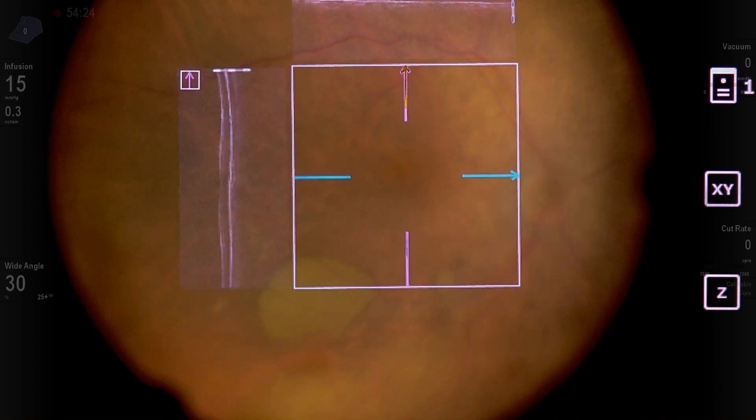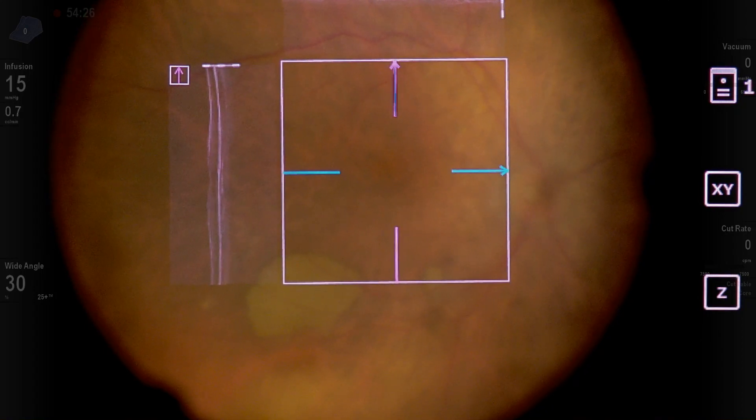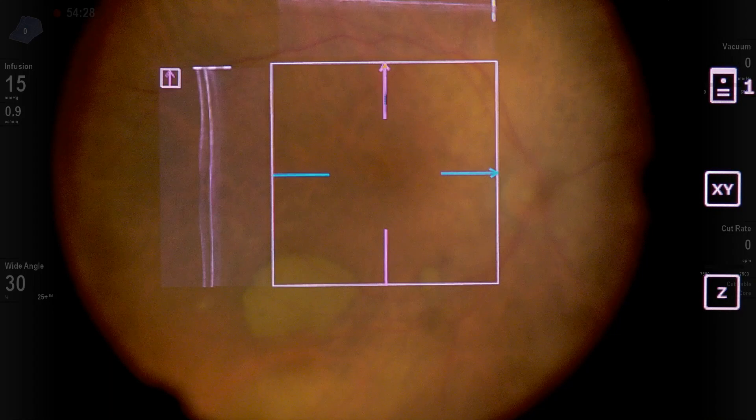Intraoperative OCT: the macula looks good. Really not much epiretinal membrane to remove. You can also see the subretinal hemorrhage, which is chronic, superior to the macula — which we're going to leave alone, of course.